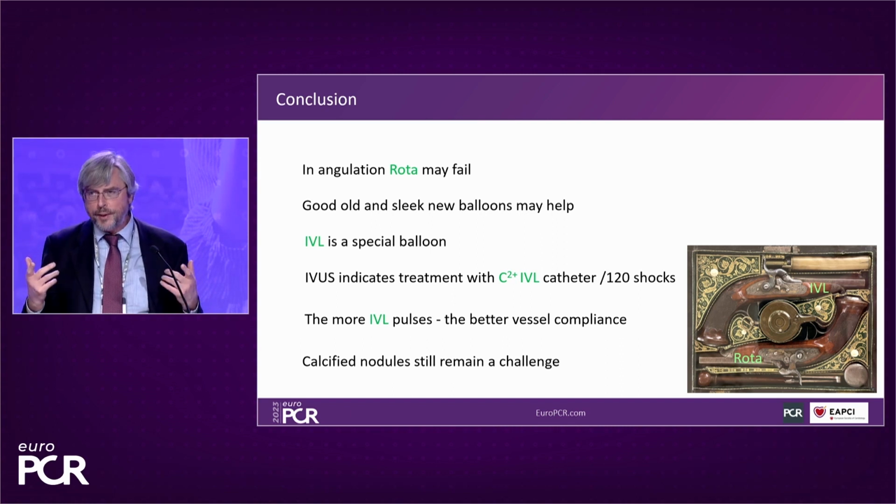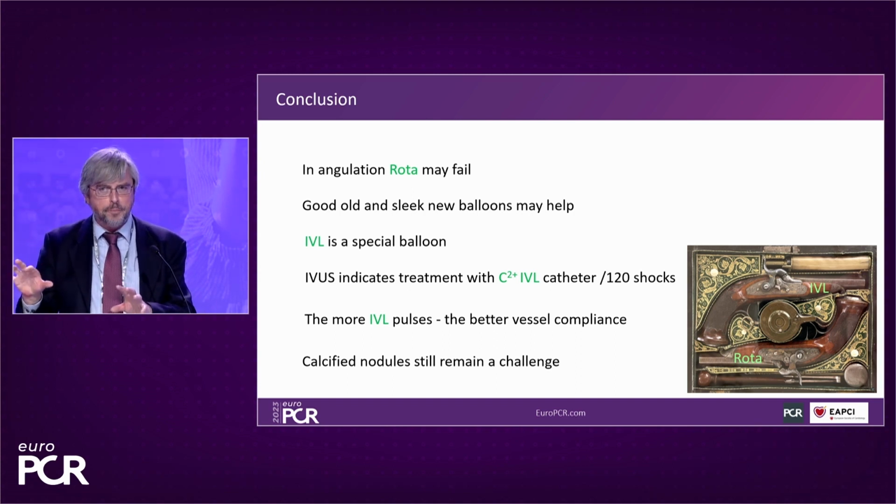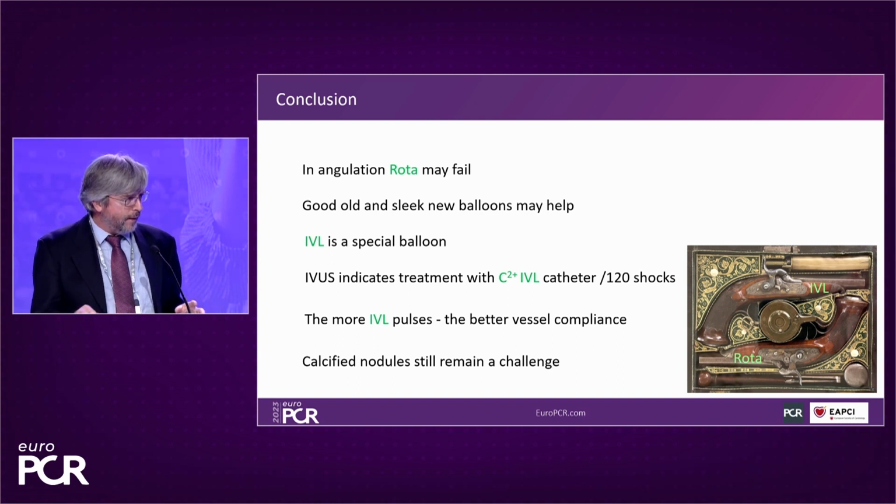But we have a theory that is coming from the vessel compliance problem. If there's sheets of calcium cracking at the spot where the most force is, keeping it eruptive, keeping it like a volcano. So indirectly, I think shockwave may help, not by hitting at the nodule, but by breaking up those sheets. Thank you.